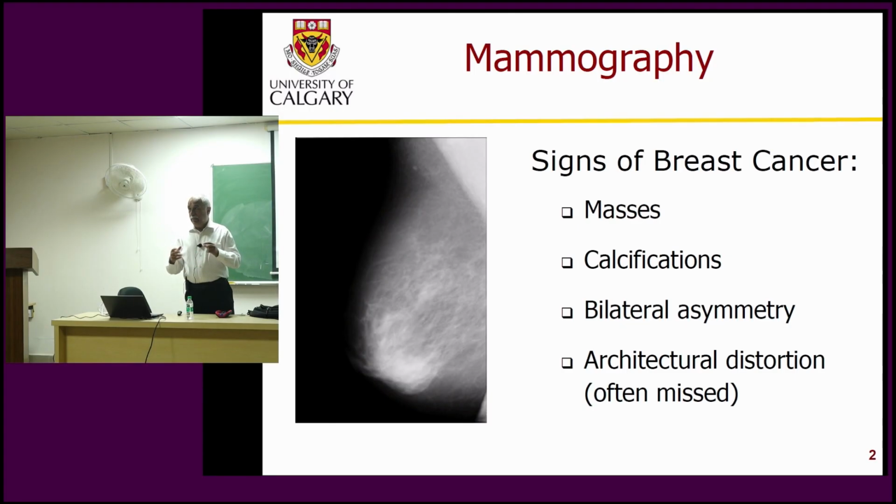So women were concerned about the radiation, the bad effects of radiation, you know that. It could cause cancer. It could cause other problems. The breast has to be compressed, it's painful. And why go there and experience this pain, and there is this potential danger of radiation. So women were hesitant to go to screening programs. And eventually it changed due to improved imaging techniques, reduced dose, improved efficiency.